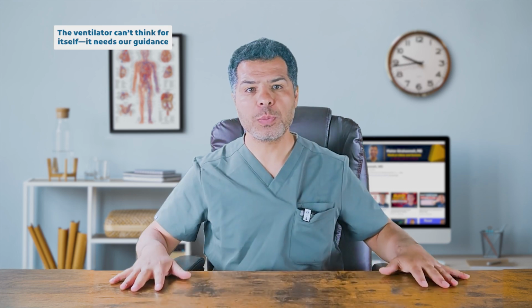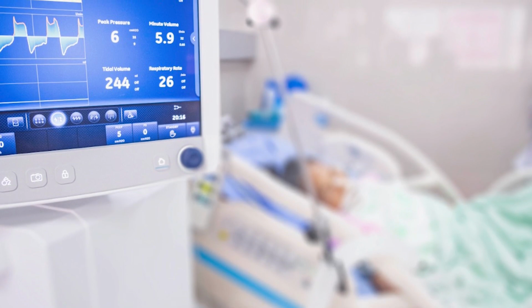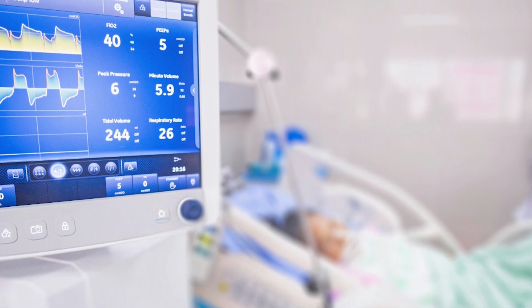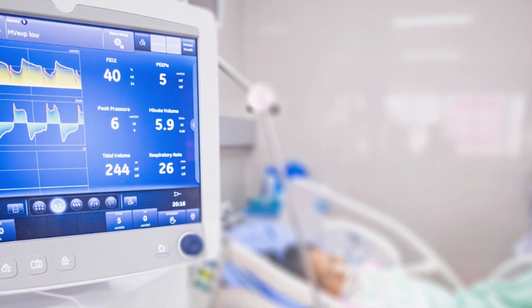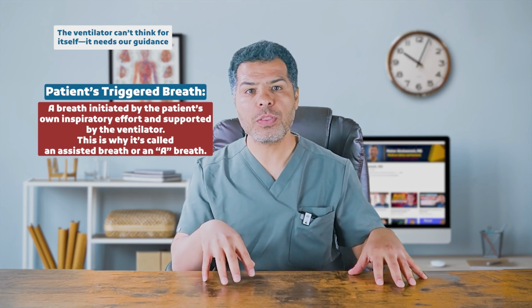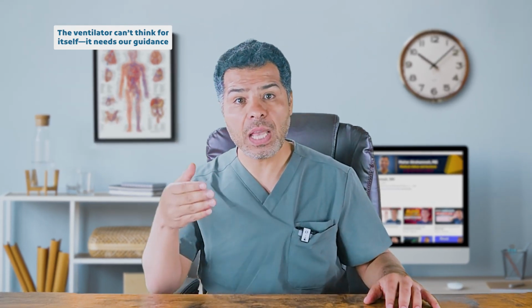Let's start with the first point, when to start the breath or inspiration. The ventilator will listen to the patient to detect any inspiratory effort. It will pick up any effort as a sign that the patient is trying to breathe, and it will go ahead and assist the patient with that breath. This is known as a patient-triggered breath, or as we call it in mechanical ventilation, an assist breath or A breath. But what happens if the ventilator does not detect any patient trigger?